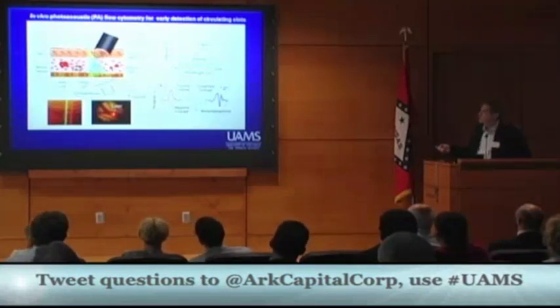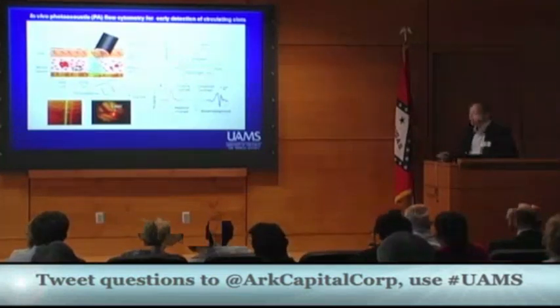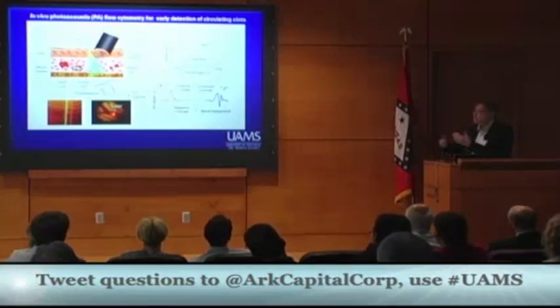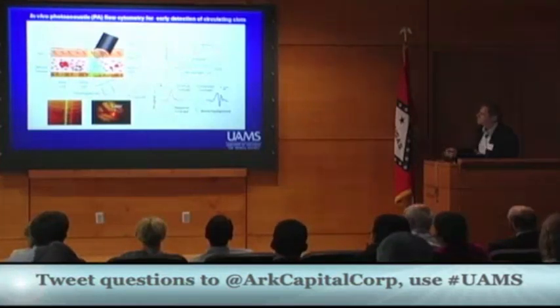How does it work? This is blood, and these are clots of different origins. They can be rich in red blood cells, which is red, or platelet-rich, or mixed, with different compositions. How did we find by mistake that we can detect them? What's going on? The laser irradiates blood vessels, and because of the red color, a lot of light is absorbed by blood. That creates an absorption background, as in absorption spectroscopy, spectrophotometry, so we have a strong background.